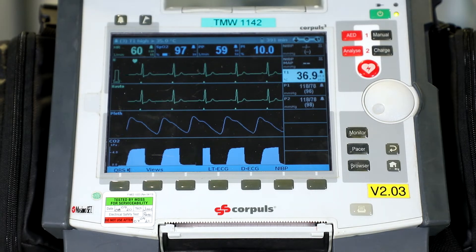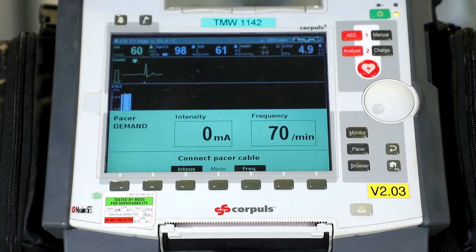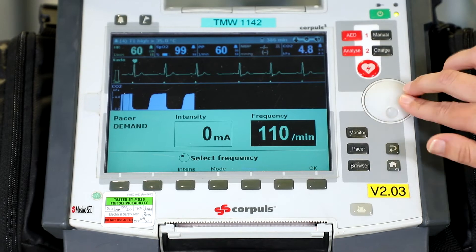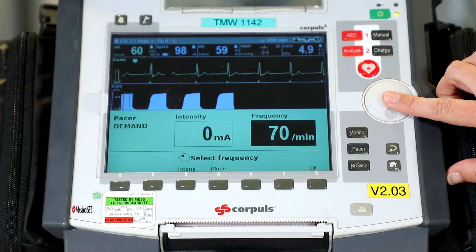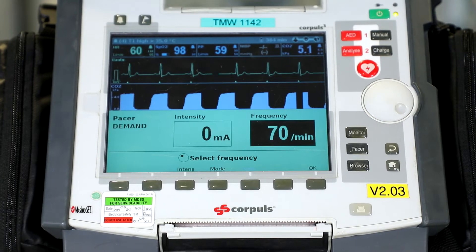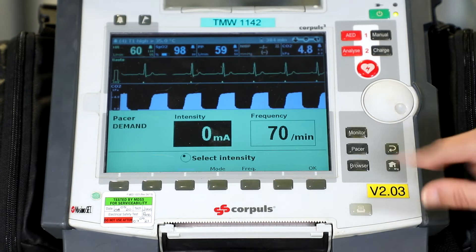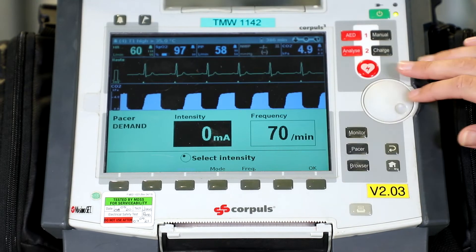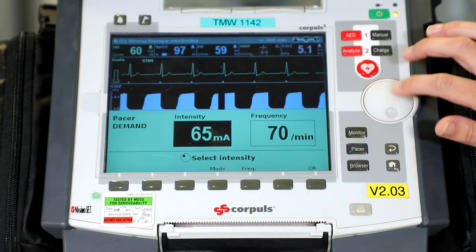The next thing is to check the function of the pacer. Press the pacer button, then select and check the frequency range by pressing the frequency button — turn it all the way up to 150 and all the way back down again to make sure this is working, and confirm with the jog dial button. Once the frequency range is checked, we also check the intensity range by pressing the intensity button. As we dial it up, we want to hear an audible alarm and also see the word 'STIM' come up on screen — we can see STIM all the way to the top — and then we turn it all the way back down again.